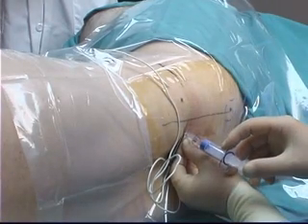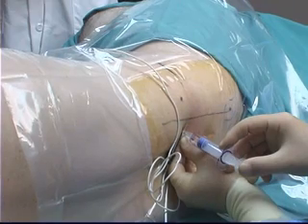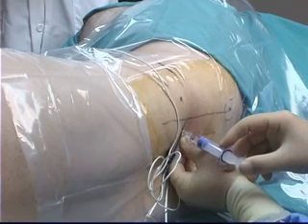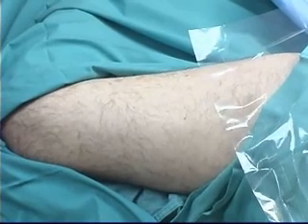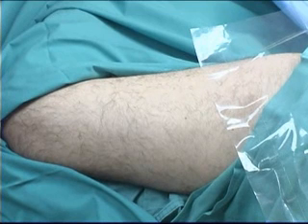In this demonstration, the needle length is marginal but just sufficiently long enough. The needle is advanced gently, and as with the other paravertebral blocks, loss of resistance to air and the motor response, quadriceps muscle twitches in this instance, appear simultaneously. This recording demonstrated quadriceps twitching, which appears simultaneous with loss of resistance to air. The nerve stimulator output is turned down, and clear brisk twitches should still be present at 0.3 to 0.5 milliamps.